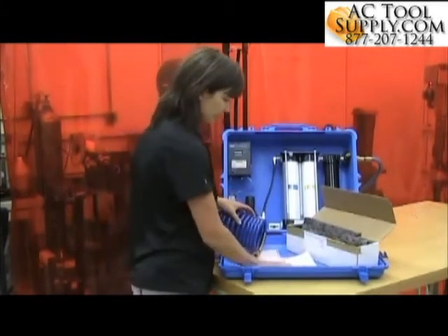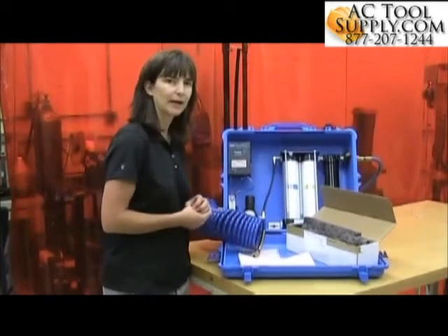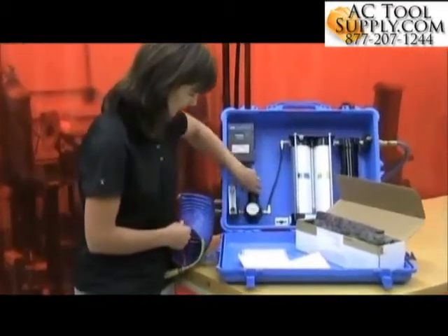According to the instructions, I need to set my air line pressure to 50 psi. So I'll adjust that here.